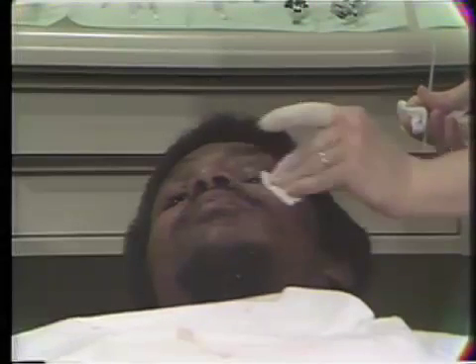See how considerate she is of the patient? Now this is a mark of a good assistant. She's even wiping off the sweat from his forehead and over his eyes. And this is what goes on in the office all the time, and this is a part of the job an assistant has to do in the office, is to not only assist the doctor, but to make the patient as comfortable as possible, because that makes the entire operation then go more smoothly for everybody involved.